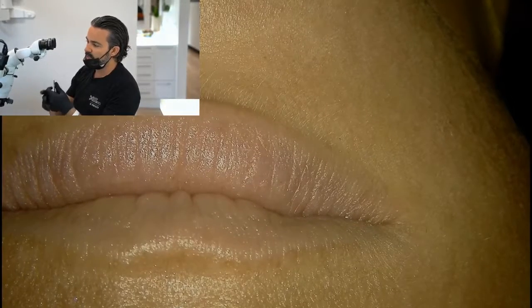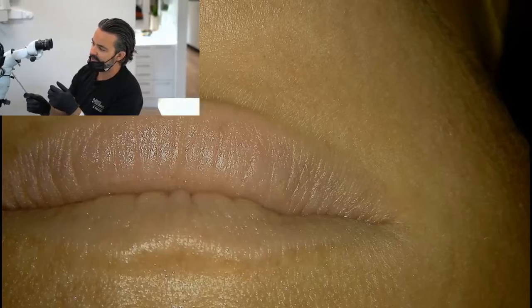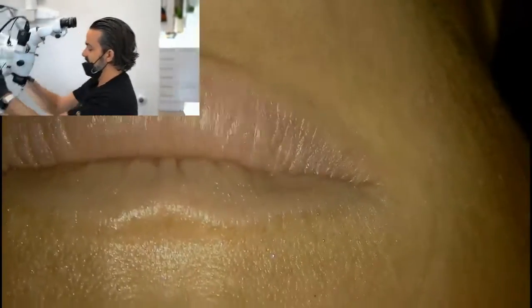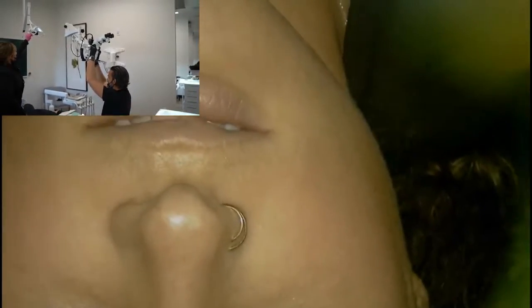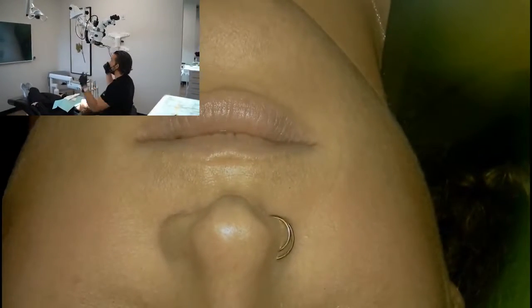The one advantage of having an adapter, like a beam splitter here, especially for you guys in general dentistry, is that you can get this out of your head, and this gives you a lot more depth of field when you're dealing with a digital camera than your own eyes. With video documentation, I can come up as high as I want, and if you look, I'm under this microscope.